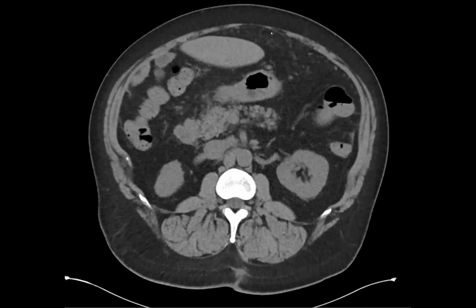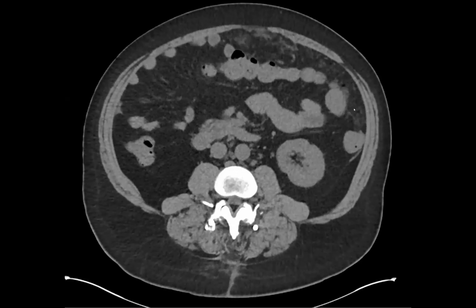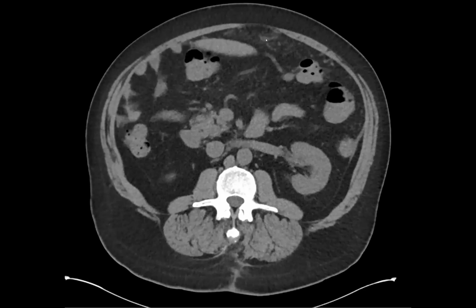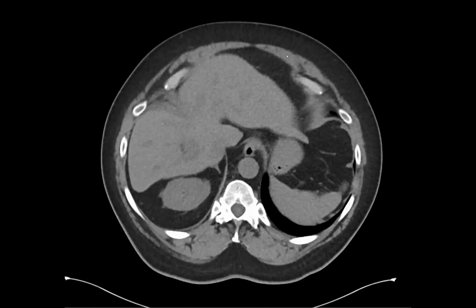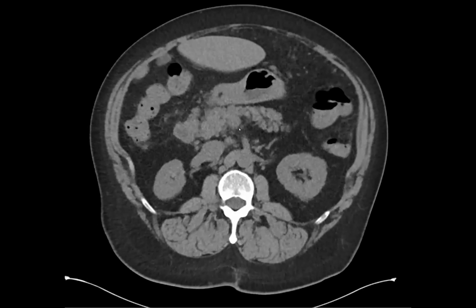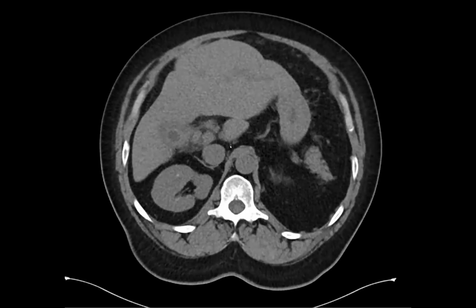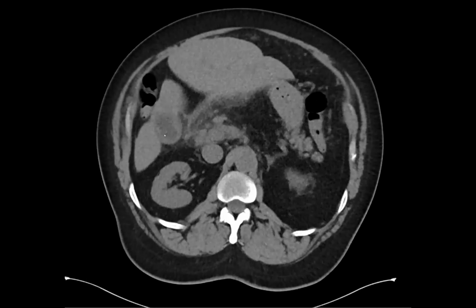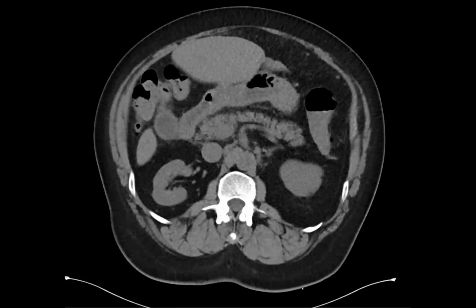Omental deposits. Yeah, so we've got some peritoneal nodularity. This is not normal. This is basically peritoneal carcinomatosis until proven otherwise. Less likely things that can cause this include TB, like dry TB, and fat necrosis from pancreatitis, but the pancreas is totally normal here. And then any other? Gallbladder wall is too thick. Yeah, exactly. So I guess we actually did read this as probably gallbladder cancer with peritoneal disease.